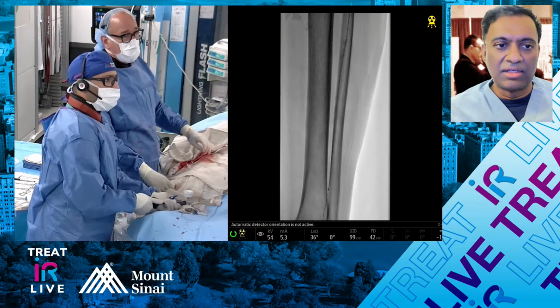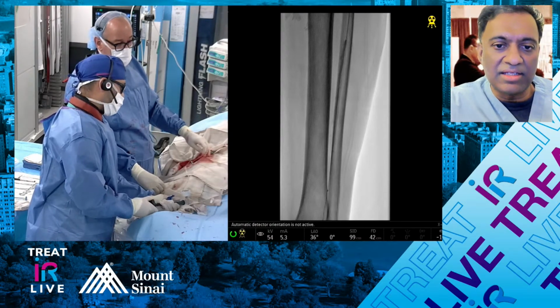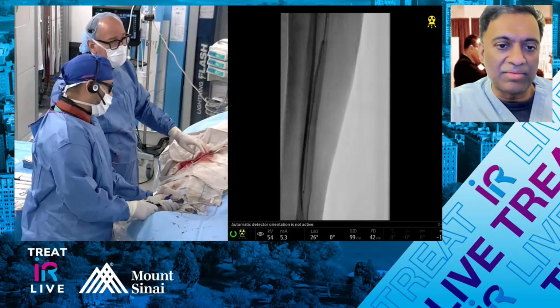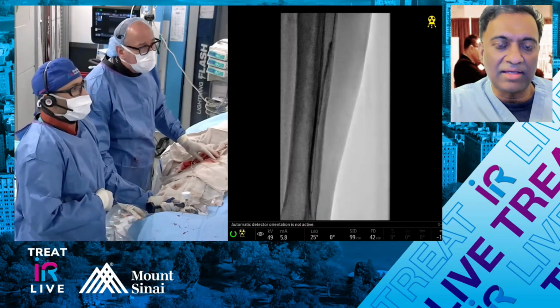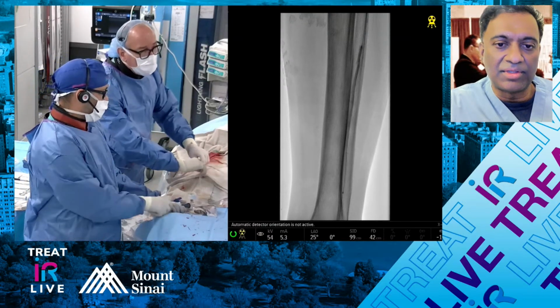Sorry. Go ahead. What were you saying? Sorry, typically I'll go revascularize the AT and see if I get pretty robust flow, and I'll leave it at that. But I don't think it's unreasonable with modern day tech to go after that TP trunk with the drug-eluting scaffold.